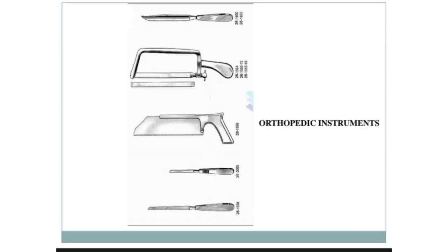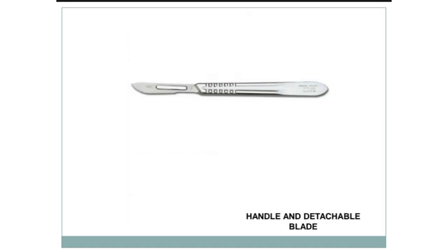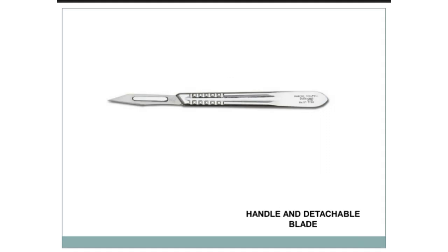So the next on our list are orthopedic instruments. This instrument is just for another video, but let me briefly say what they are used for. They are used for treating orthopedic disorders, musculoskeletal problems, and injuries. Okay, so we have handle and detachable blade. This handle is called the Bard-Parker handle. They are used alongside surgical blade for tissue separation and other procedures that require a sharp surgical blade to puncture or cut.